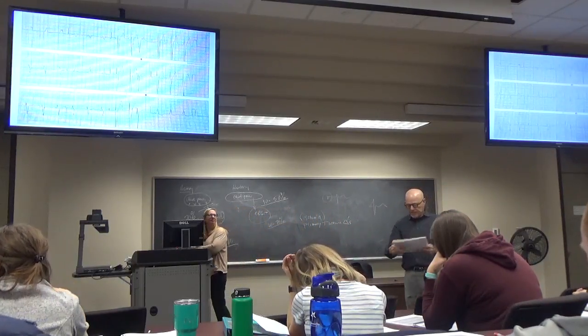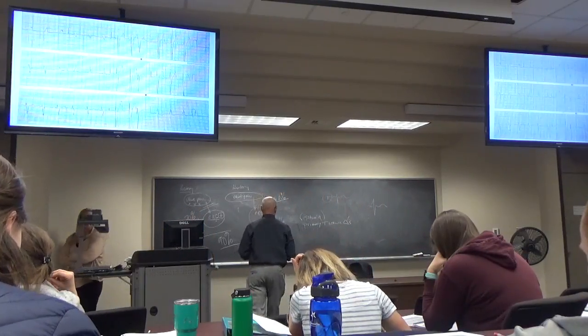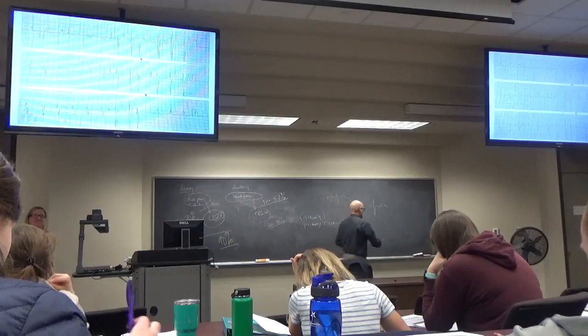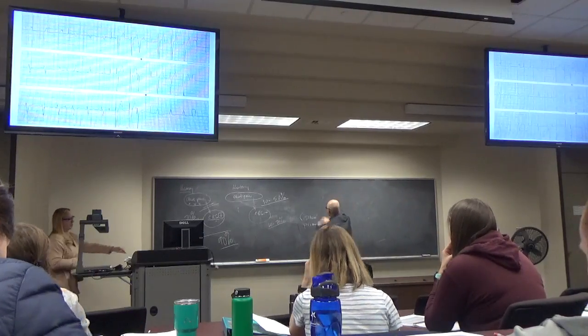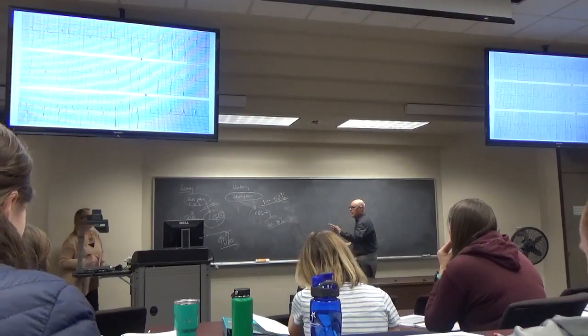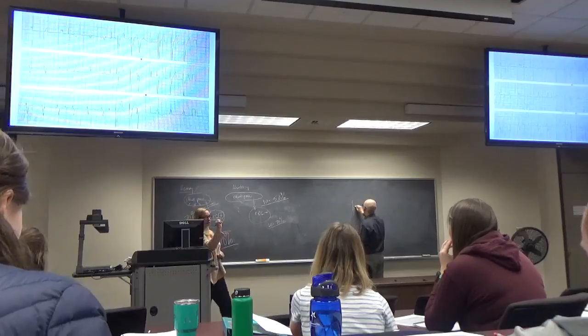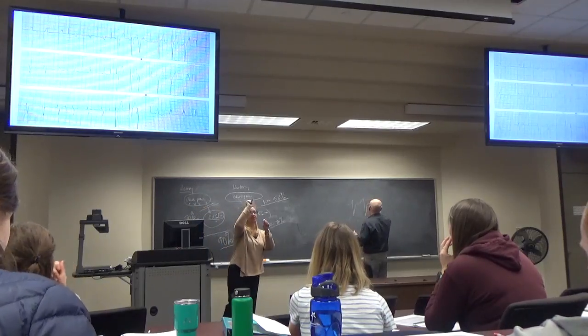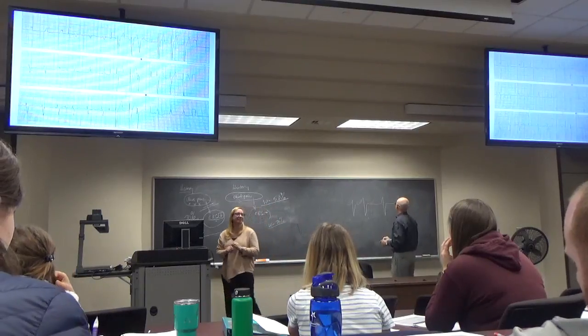Is that a PVC in B1, 2, and 3? Yes. Process of elimination when you're doing your test. You're looking at that choice and you're looking specifically at whether this is present. If it's not, then that's not the answer.